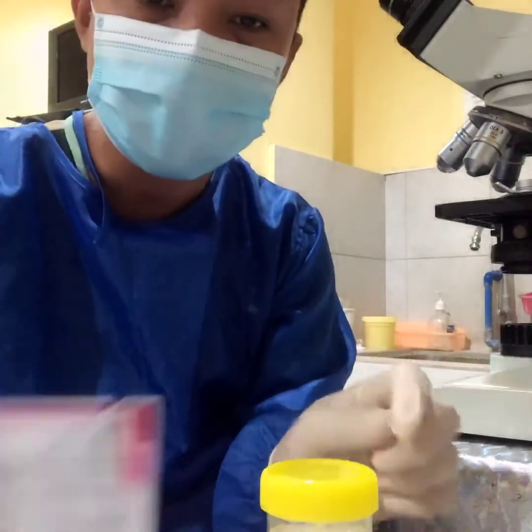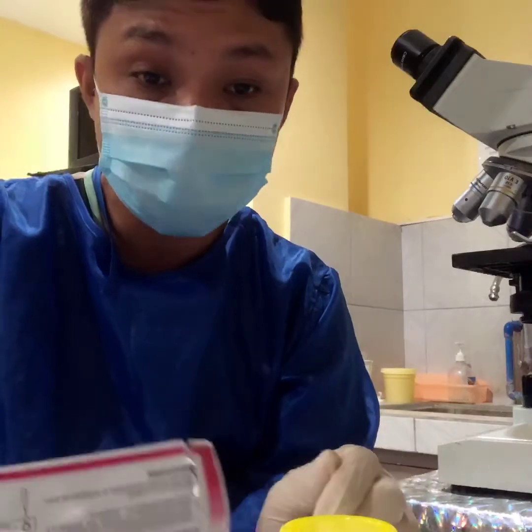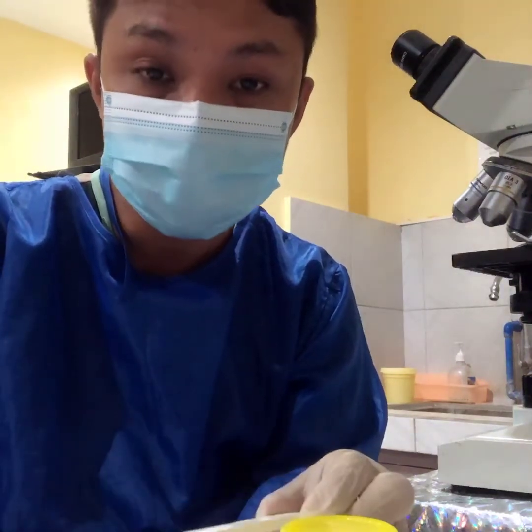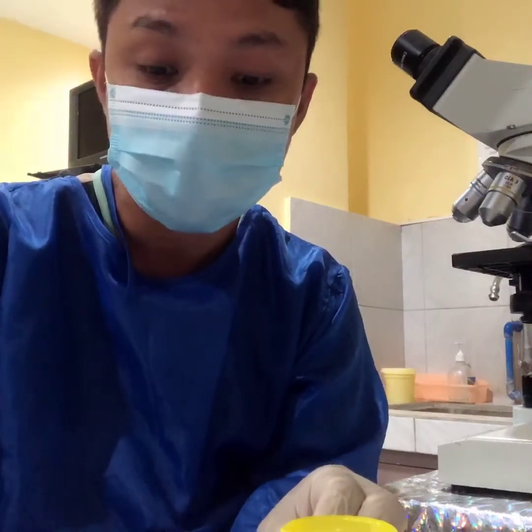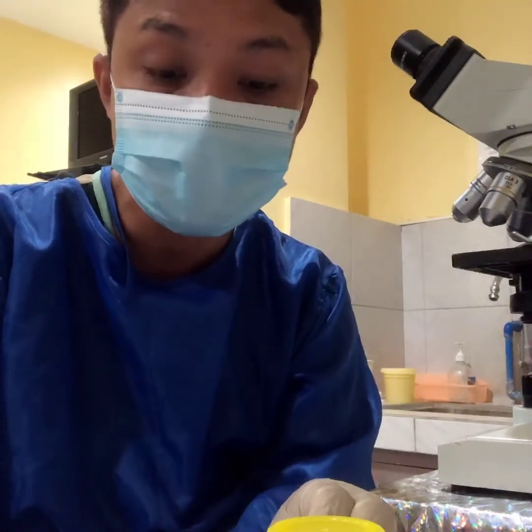Ideally, for the pregnancy test kit, the sample can be a serum sample or a urine sample. Just check your test kit whether you can use only a urine sample, or whether the kit also allows you to perform the test on a serum or blood sample. In our case, for this test kit, I think it's only for urine, to determine whether the test result is positive or not.